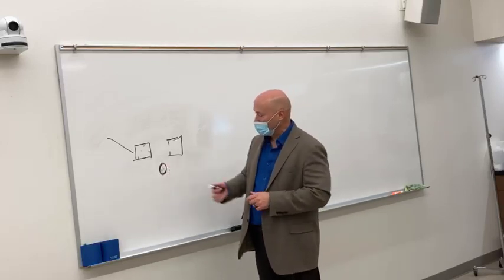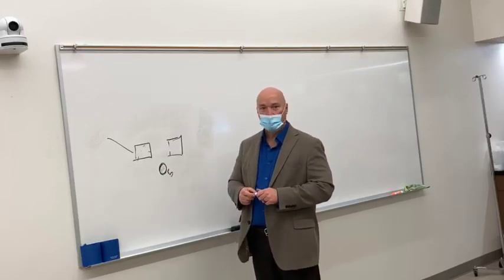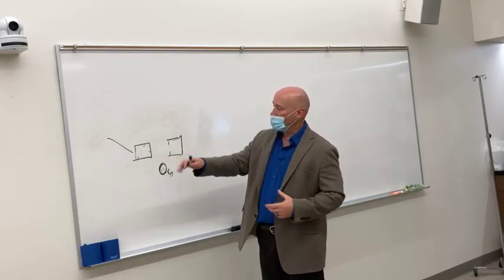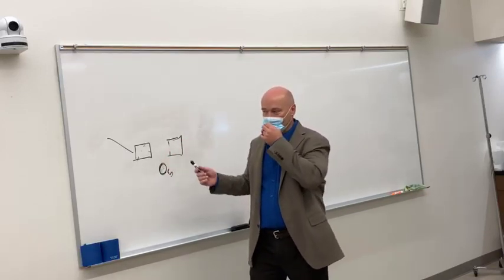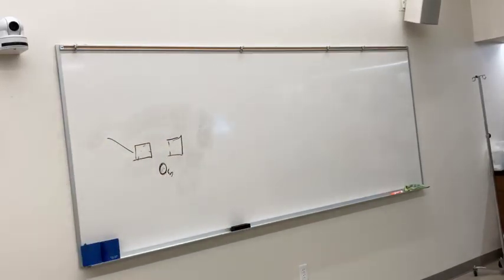So is it going to take that one longer to get to 5? Absolutely. So you can manipulate your exposure by manipulating cell selection as well, but the easiest way to do it is to go with those. So cell selection plus the density selection as well. Density, exposure, selection.